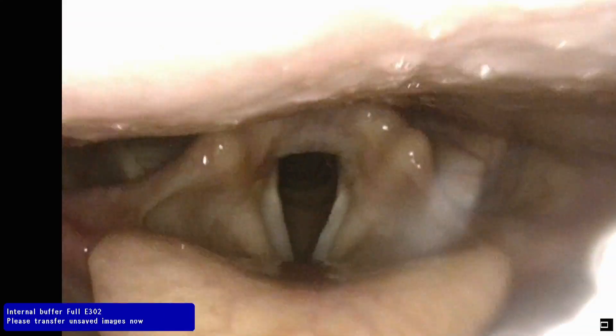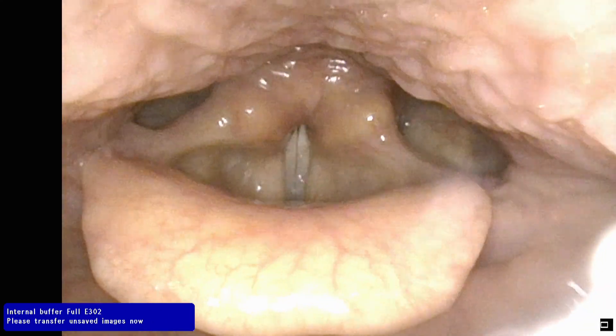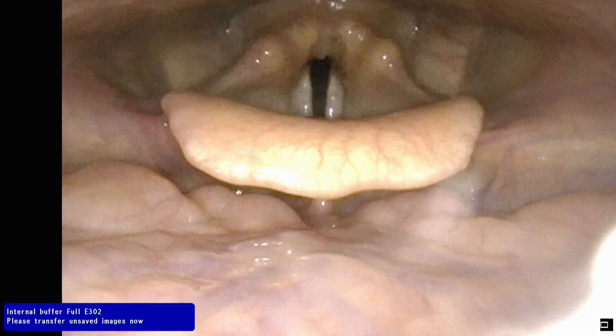Good. Now try to do a high-pitched E. It doesn't work. That's okay. That's what we need to see.